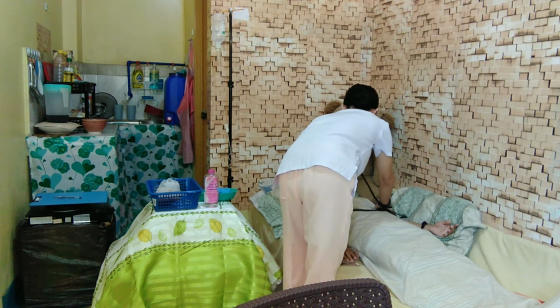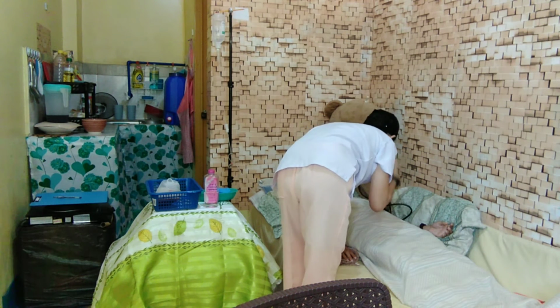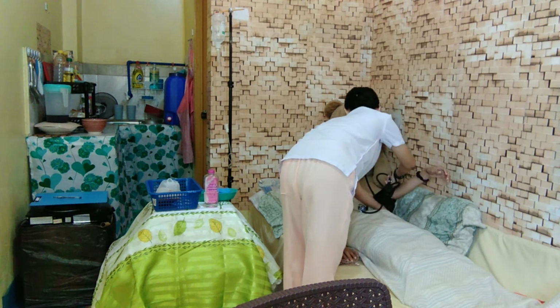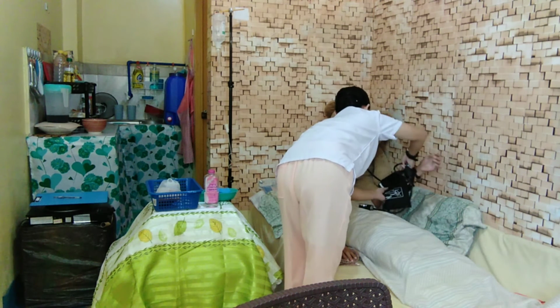I'm now going to take your blood pressure, ma'am. Your blood pressure, ma'am, is normal, which is in the range of 100/80. Thank you. Now going to remove the cuff. Okay.